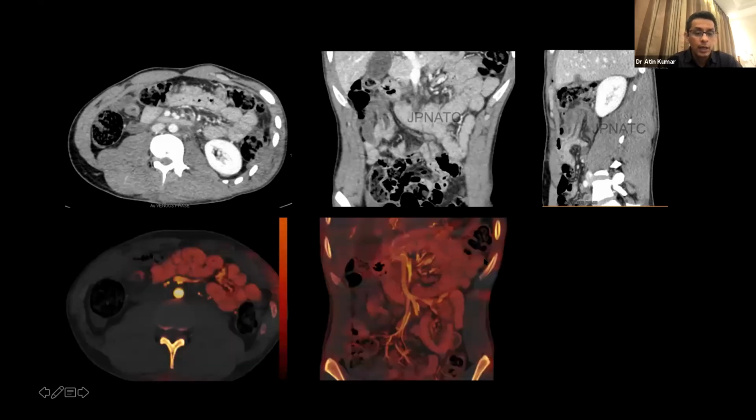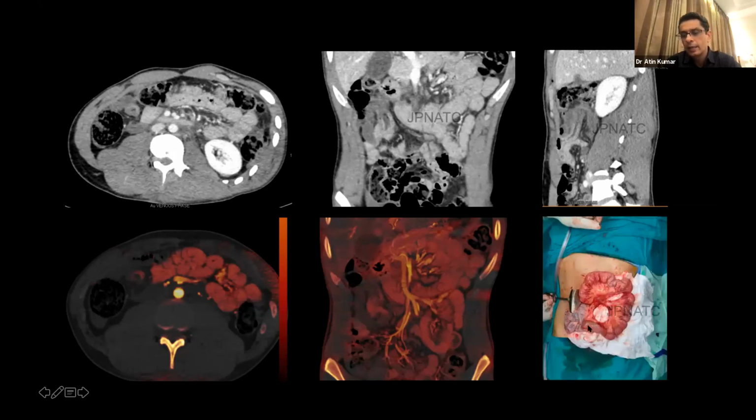We also have the liberty of using a dual energy CT scanner, which is available in our trauma center. A dual energy CT scan can better visualize and pick up these non-enhancing areas by the iodine overlay maps. So this gives us confidence that this is a non-enhancing bowel loop. This patient was again subjected to surgery, and a non-enhancing, non-viable bowel loop was confirmed along with the mesenteric injury.